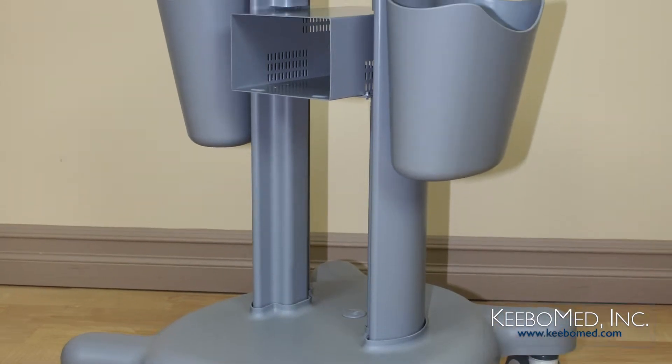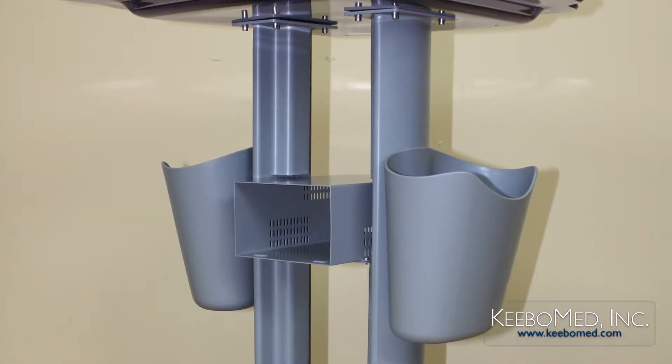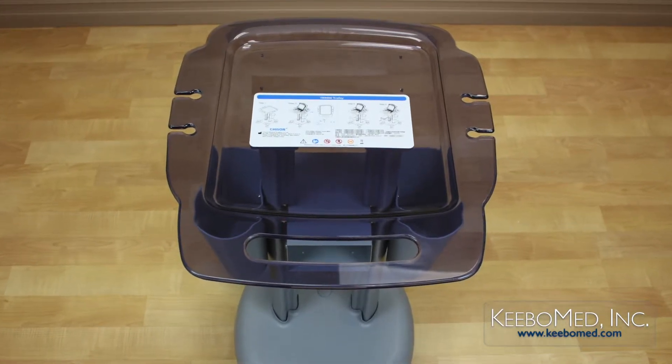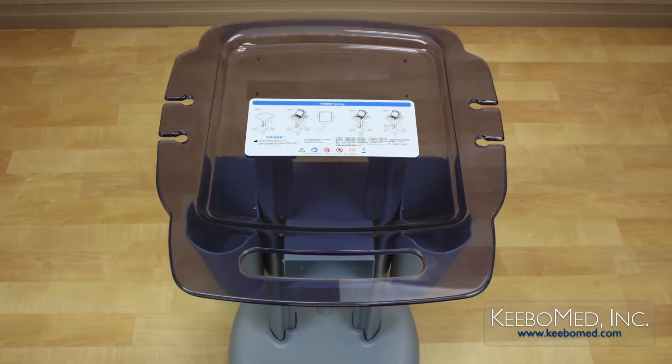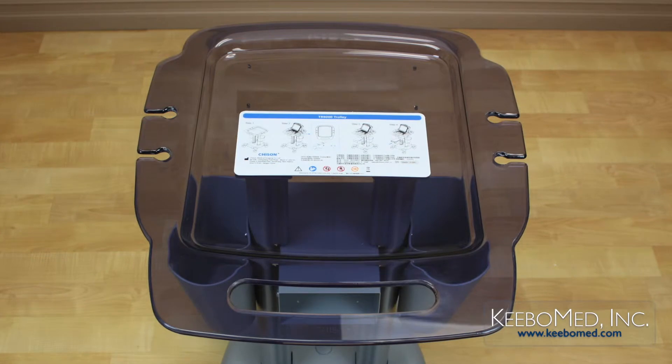The height of the TR9000 is approximately 33 inches. The top platform is large and fits Eco Series ultrasounds perfectly in the middle, and is also compatible with other portable ultrasounds of similar size.